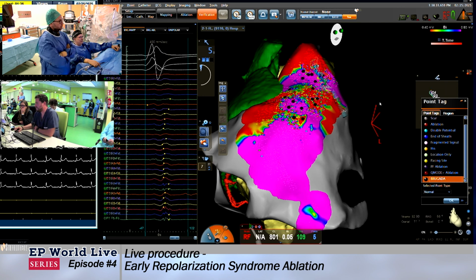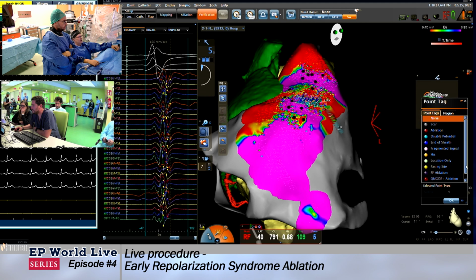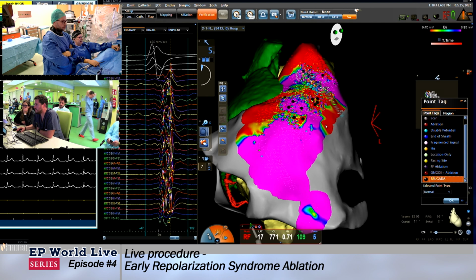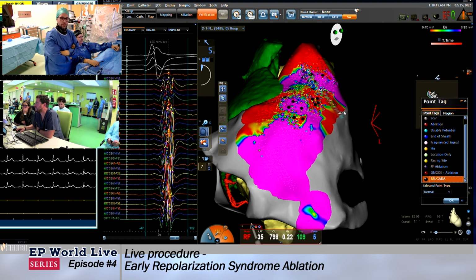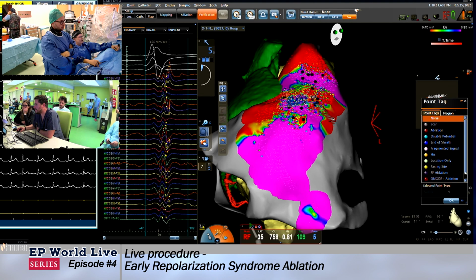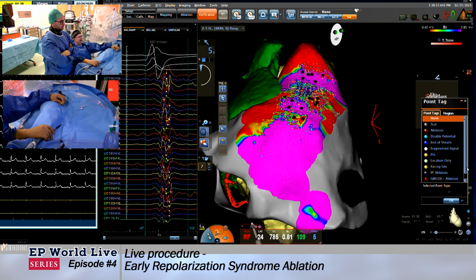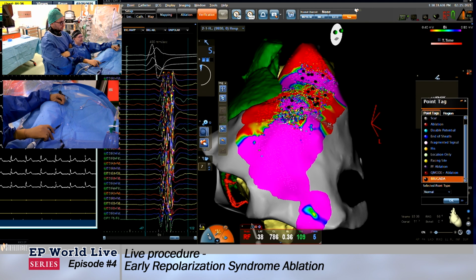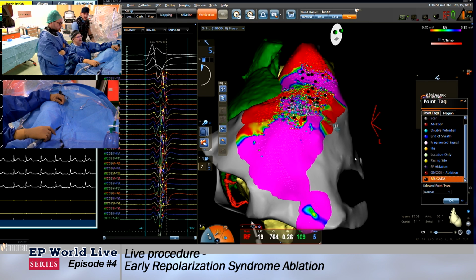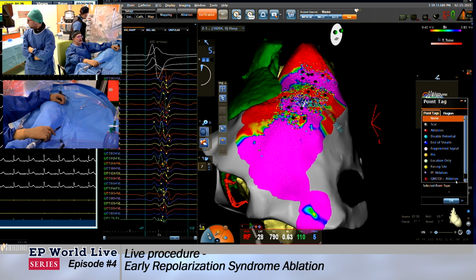This is unbelievable technology to map this type of arrhythmias. You can detect with these 32 electrodes, everything is detectable. Everything, see, is very clear. These are unbelievable fragmentation and abnormal substrate. So the only way to predict the risk of this patient is the identification of this region. Unfortunately, the EKG does not always correspond to the site of the substrate.